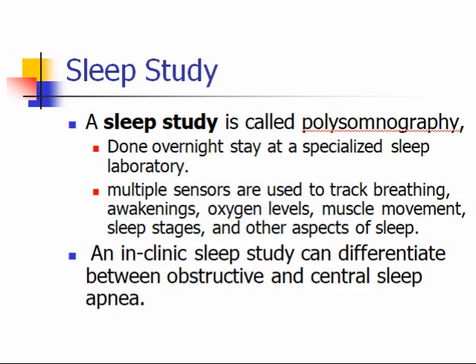Now, you'll find that there's a multitude of sensors that they hook onto the head, under the nose. All of these things are used to track the breathing, track when you're awake, track your oxygen level, your muscle movement of the chest, identify the stages of sleep that you're in, and other things that they look at.